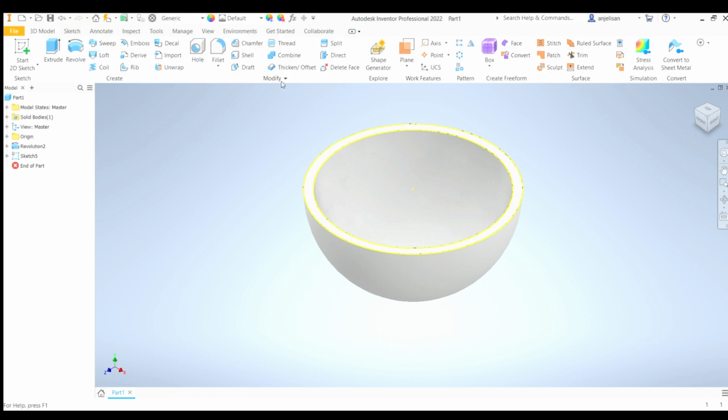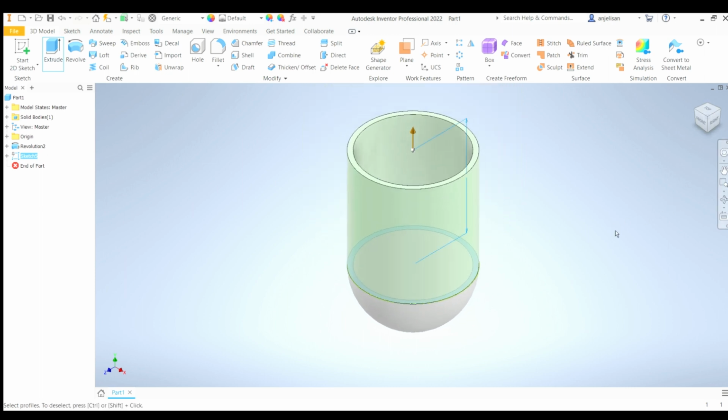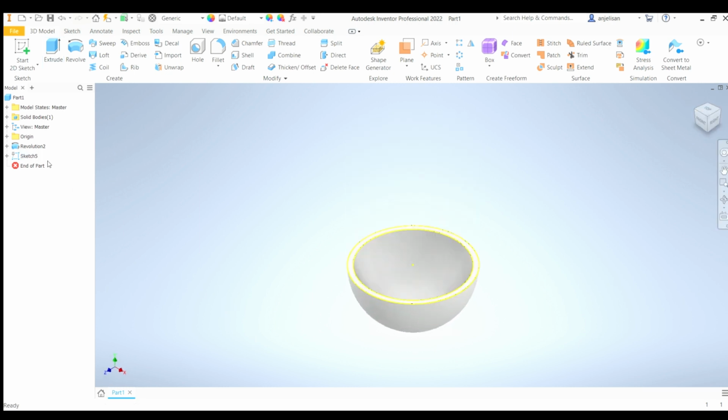And so we hit finish sketch, and then we go to extrude. It wants us to select the profiles. Go ahead and select the profile that we just projected, highlighted in green. And you can, by the way, double click the middle mouse scrolling button to automatically zoom out to fit your thing. And then you can see that it extruded that part up. You see that the hole remains. Actually, I do want to do one thing before I forget.